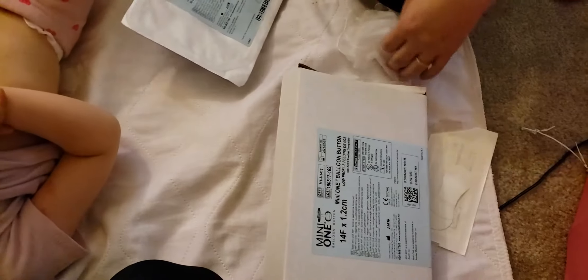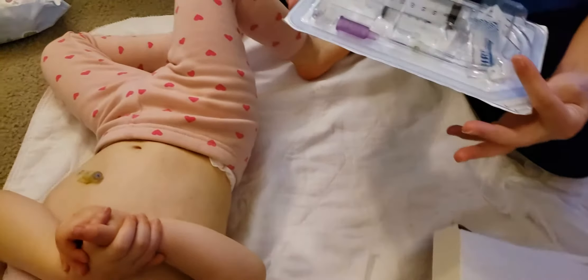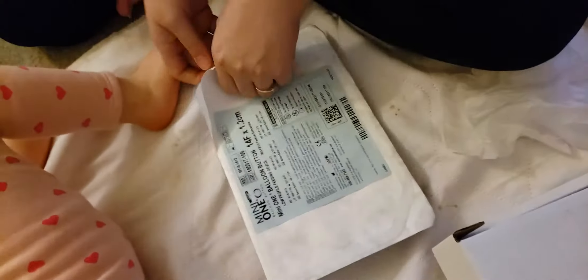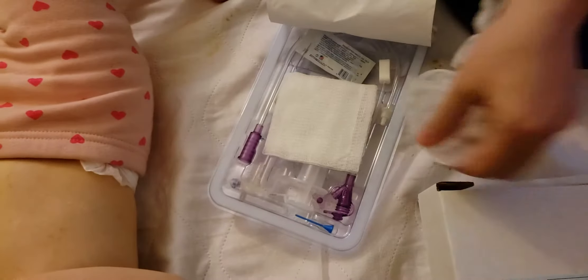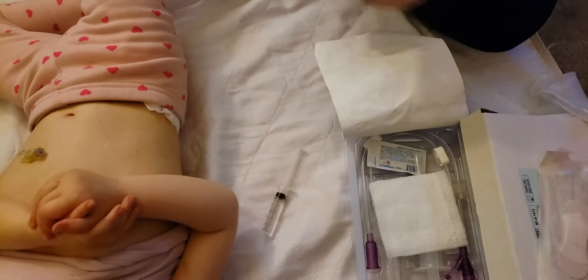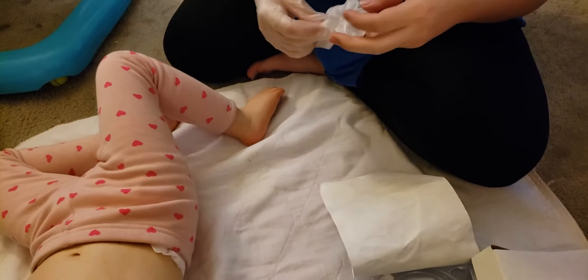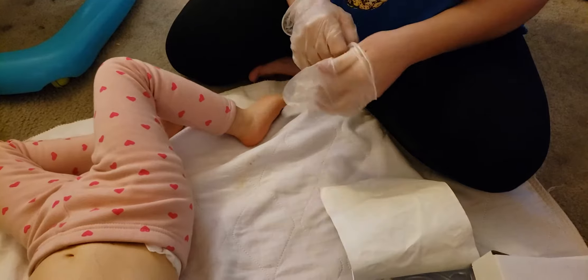I just wanted to show that I got my gloves and I made up a syringe of water for the new balloon, her sticker, and then the bag that we're gonna throw away, and the kit that all comes together. So first I'm gonna open up the kit and make sure I have everything available, because it doesn't take very long at all once you've done it a few times. But it can be very scary if you've never done it before — make sure you put your gloves on.